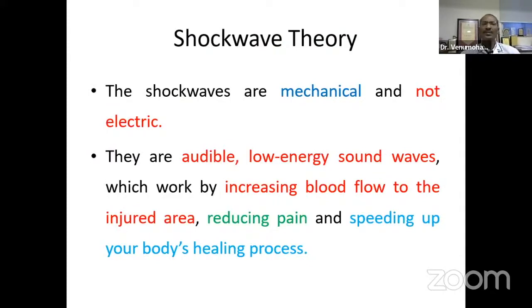Now, first, we need to understand that whenever we hear the word shockwave, everybody thinks it is electric, but it is not electric, it is mechanical. These are acoustic waves, sound waves. And they work by improving the blood supply to the injured area, reducing the pain, and also speeding up your body's healing process.